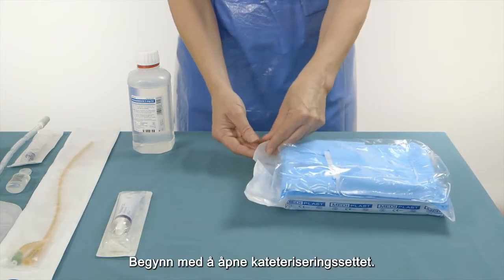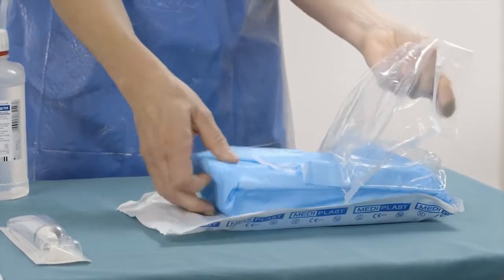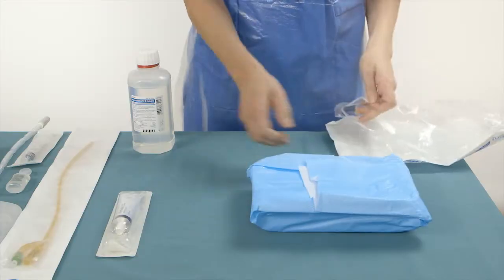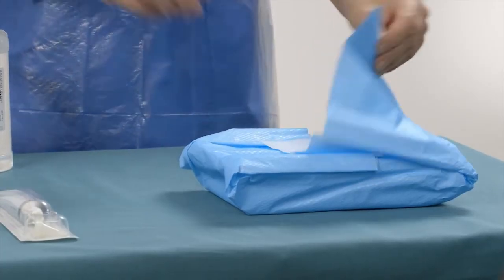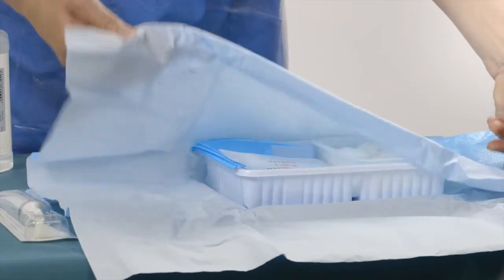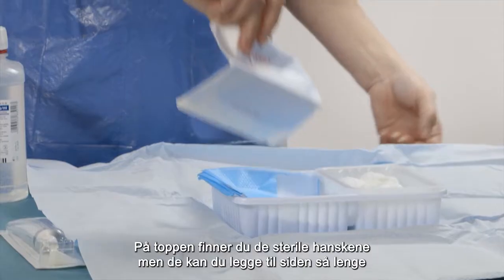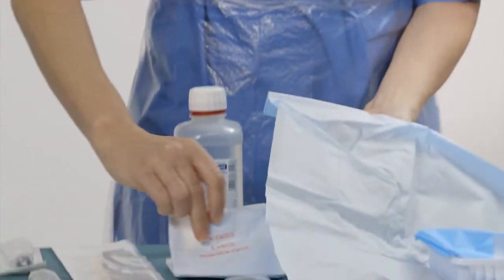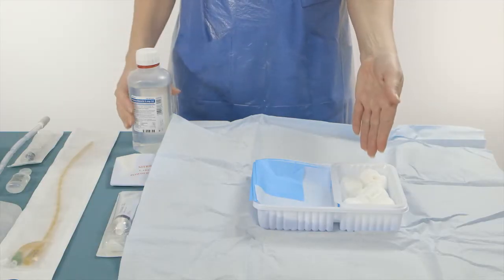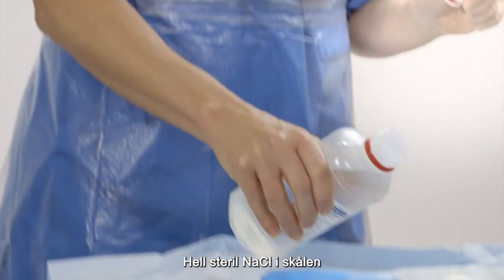Start by opening the catheterization kit. First, you will find the sterile gloves, but you can put them aside for now. Pour some sodium chloride irrigation solution into the tray.